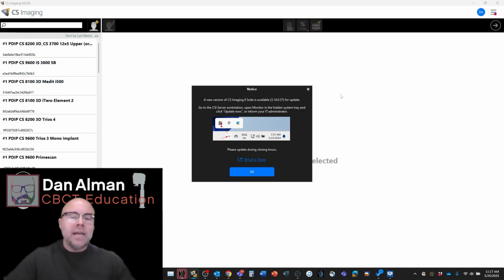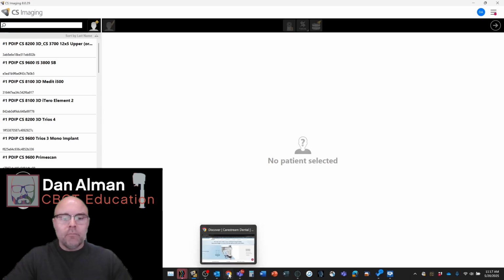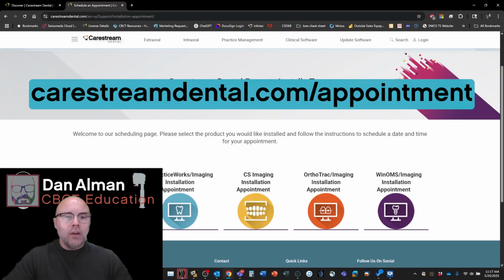OK? The next thing is I get calls often from customers saying, hey, Dan, I got a new computer. I need to install the imaging software on it. What's the easiest way? Usually it takes me just a couple of minutes to run them through how to do that, or I take care of it for them myself. But really the easiest way to do that is just to go to carestreamdental.com/appointment, and that's appointment singular, and then go to CS Imaging Installation Appointment.